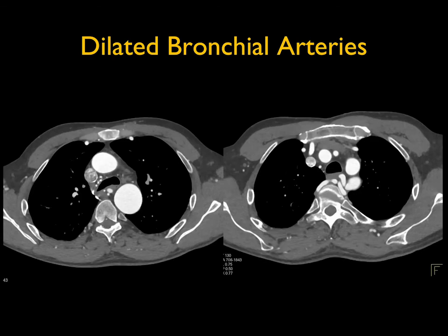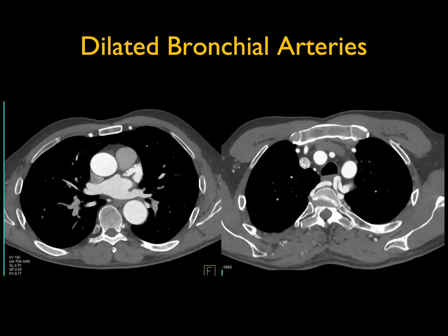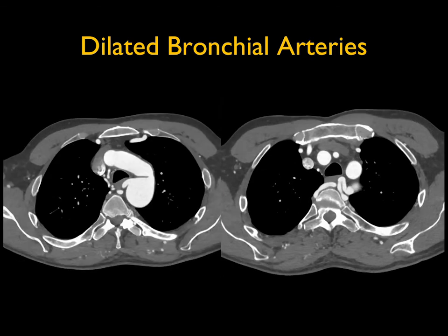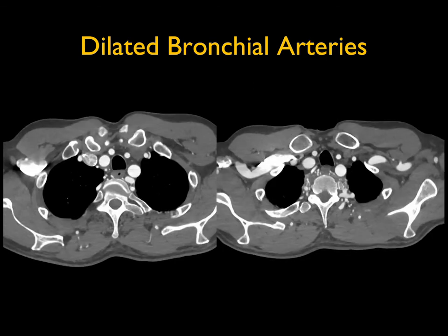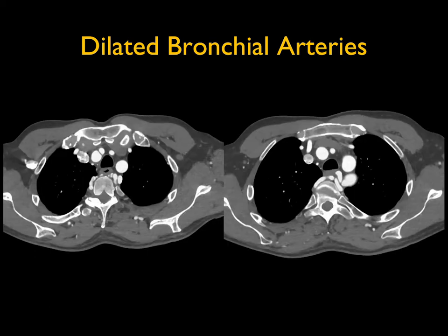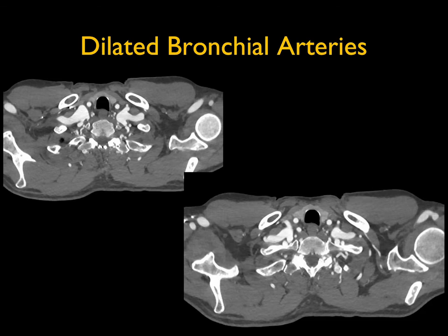This is an interesting case: dilated bronchial arteries can be confused with nodes, particularly on non-contrast scans. You can see the dilated bronchial arteries here — we can see this with tumor, with pulmonary artery stenosis, with prominent collaterals due to compression of other vessels in the mediastinum, or as part of congenital heart disease. You can see very nicely the branches of the dilated bronchial arteries coming off the aorta in the posterior, middle, and anterior mediastinum — it's one of those things that can be somewhat confusing at times.